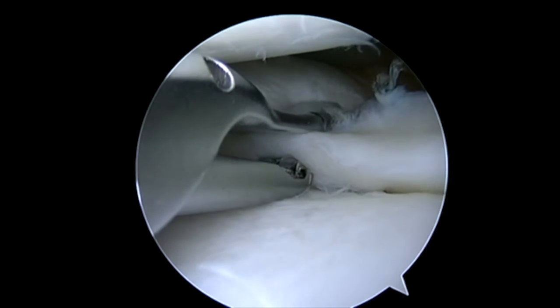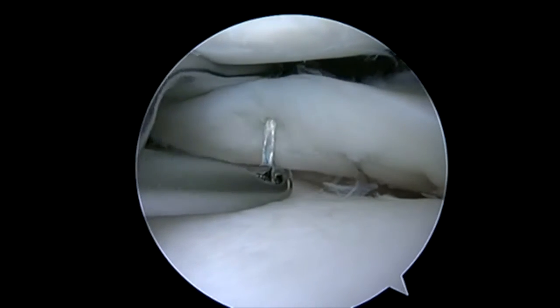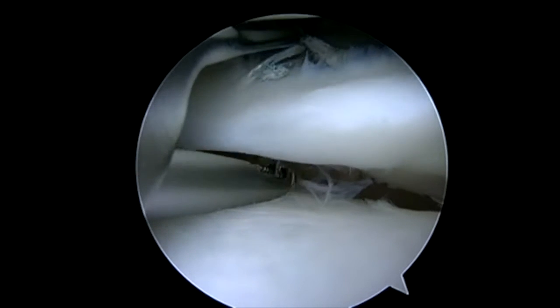I'm pushing a needle on the center pass first. There are different ways to pass the sutures depending upon the tear pattern. You may want to pass peripheral or at the rim first. Otherwise, sometimes it's easier to pass central.